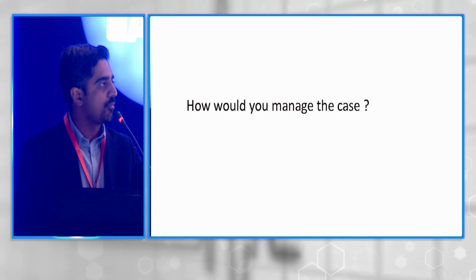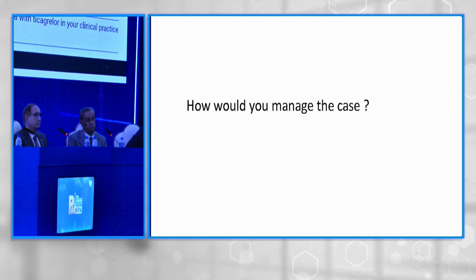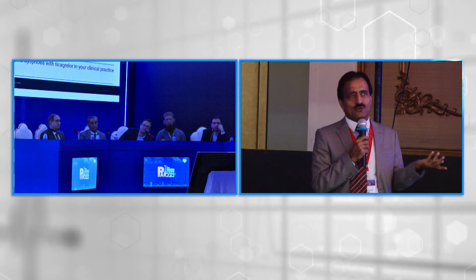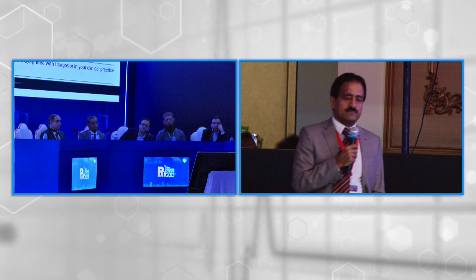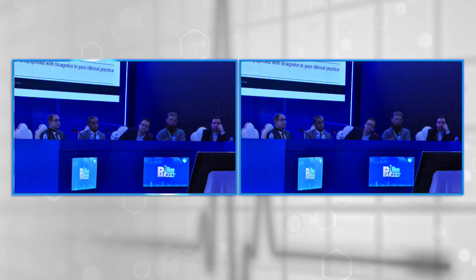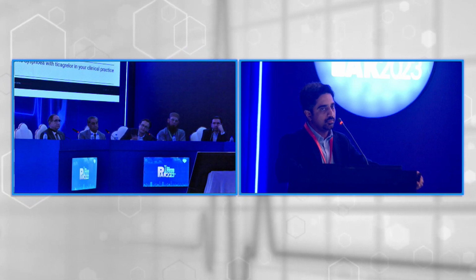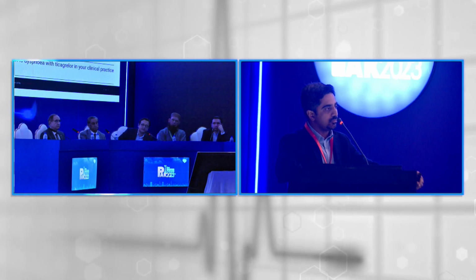I think a couple of issues. First, there is a sort of ISR of that ostial circ as well. Do you think this is ISR because it's an 8-year-old stent, maybe underdeployed, a smaller stent that has been put in probably on an under-prepped vessel? The question now is whether you should try stenting the LAD or you should consider CABG at this point, because if there's a stent failure already and you're going to have to fix that as well as fix the LAD. So maybe CABG is one option that you should consider in this case.